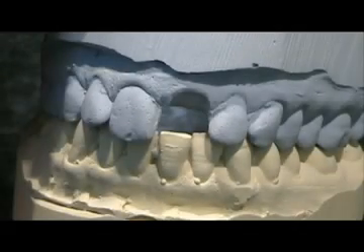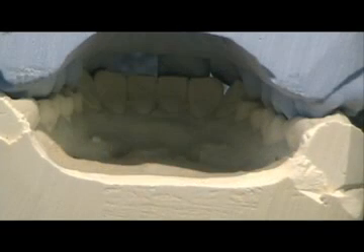The dentist provides either opposing full arch impressions and a bite, or models and a bite, plus the shade for the restoration.